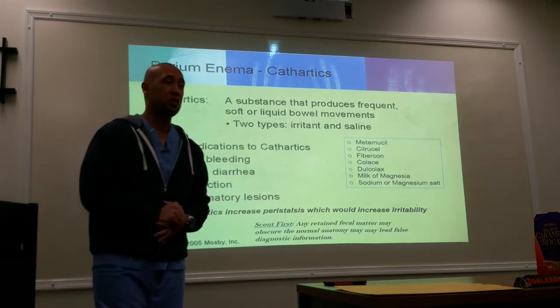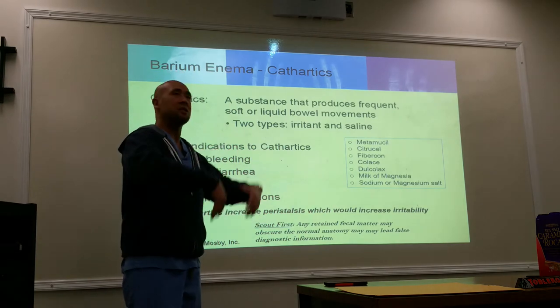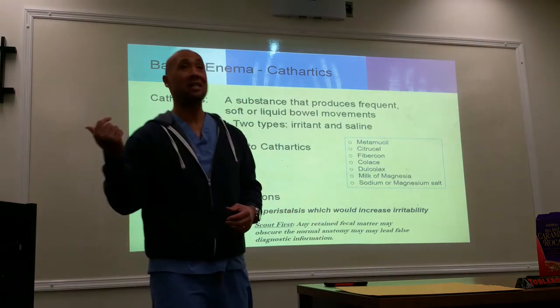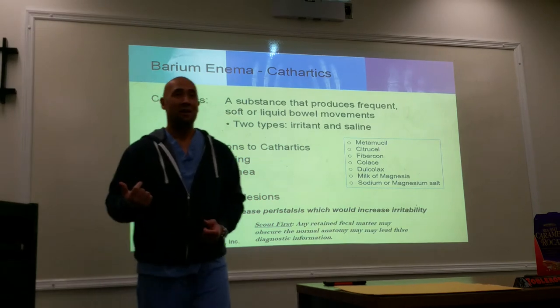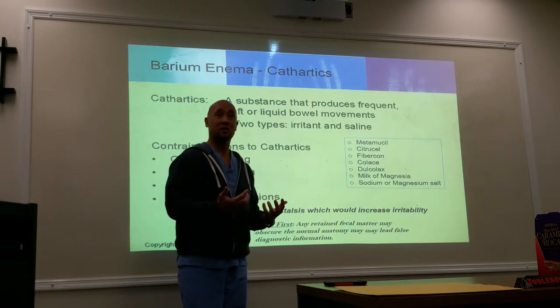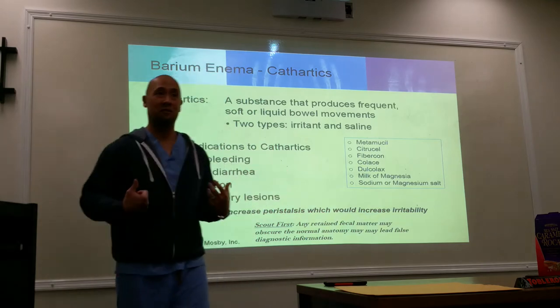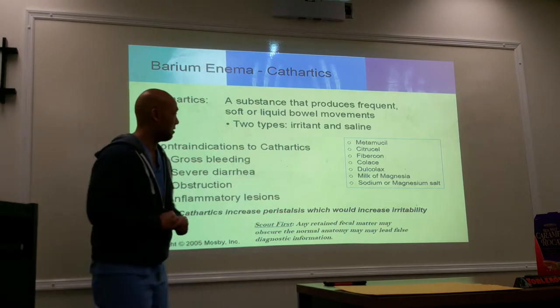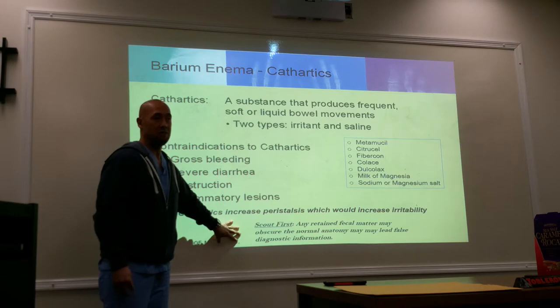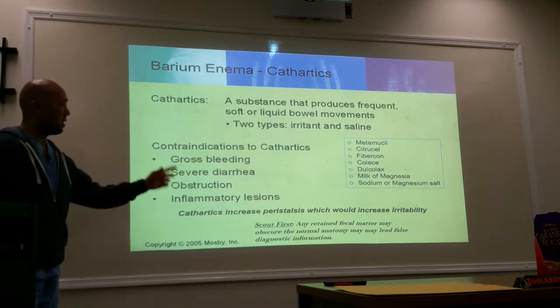So the first x-ray that you're going to take after you bring the patient into the room, you get them undressed. So what is the preparation for the procedure? Take it all off. Exactly, take it all off. Don't leave anything on, and you want to remove everything, not only because it may get in the way of the pictures, but they may have an accident. If they're wearing a t-shirt, then that's an issue. It's going to be nasty, okay? So, scout first. Get them undressed. Remove everything from the waist up. You're getting the history, and we'll cover that in just a moment.